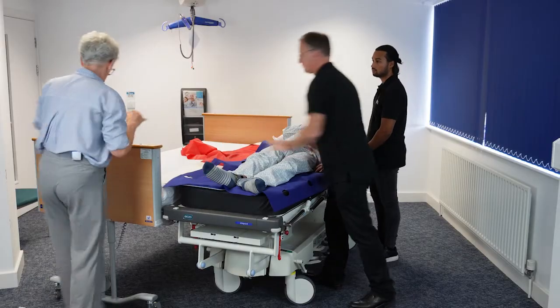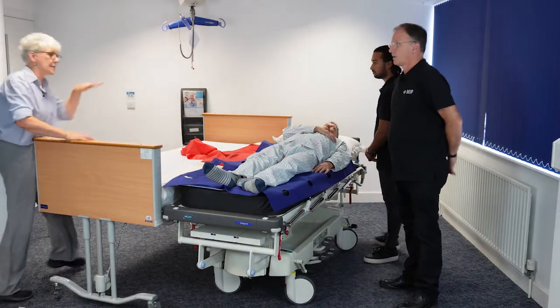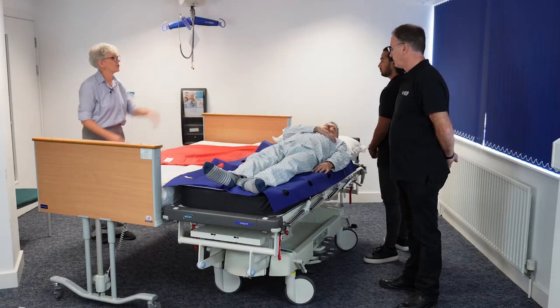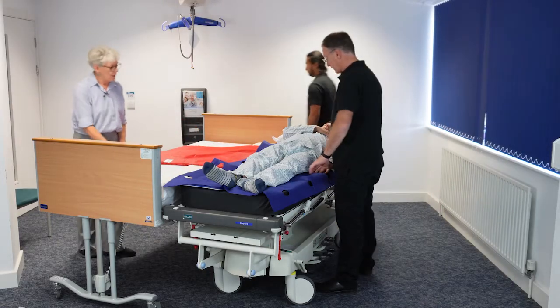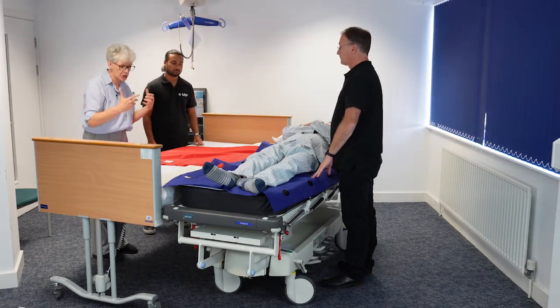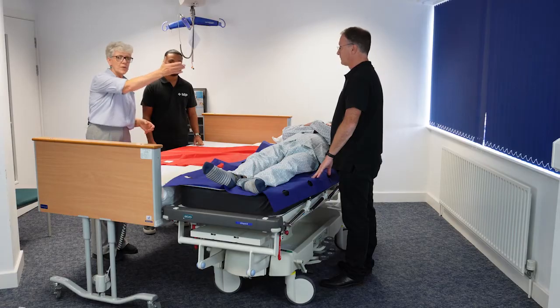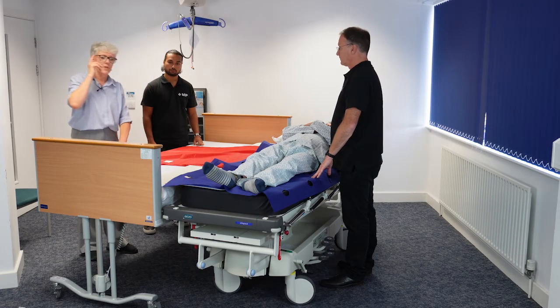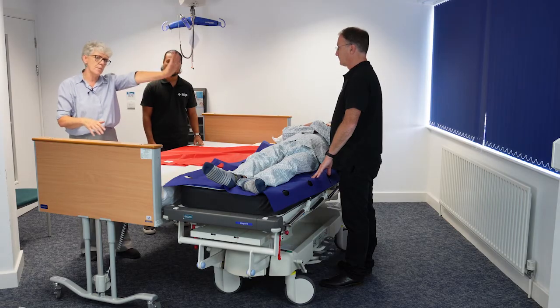Having the surface that you're coming from slightly higher than the surface you're going to can sometimes be useful. What we're going to do here is do it really gently — there's no need to rush with this task. We've got one person doing a push technique and we're going to gently pull. The first move is very much initiated by the pusher.